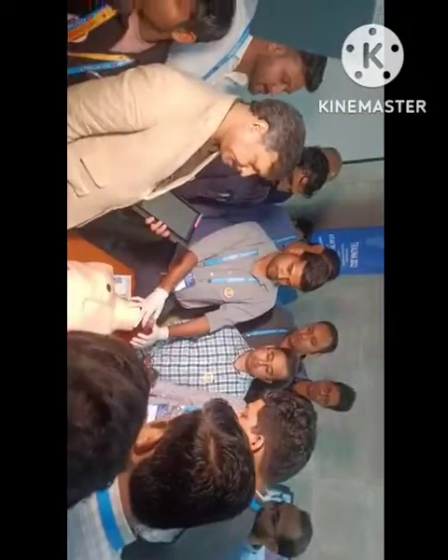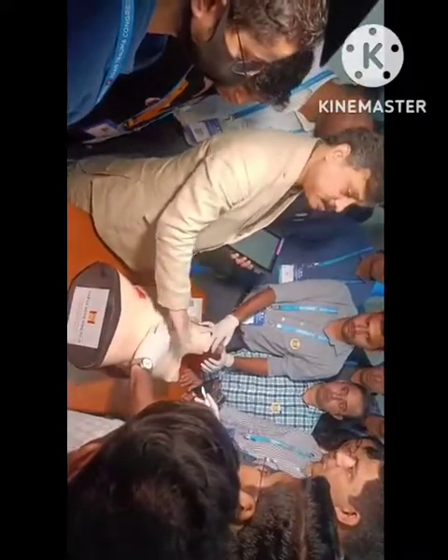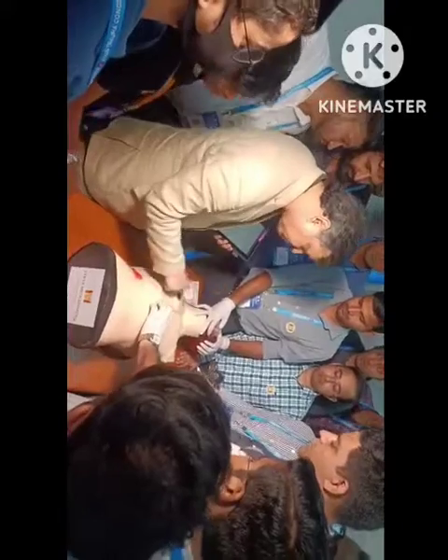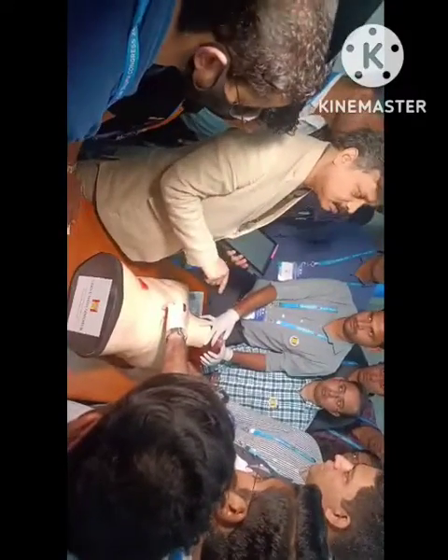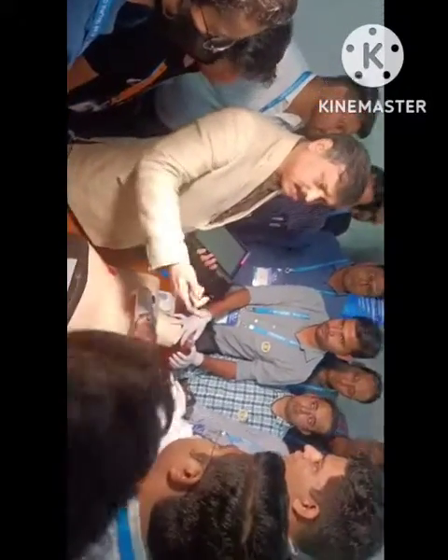I will start my incision from the mid-axillary line to the sternum, just left lateral to the sternum. I will differ from you. We will always start the incision from the right side, even for left anterolateral, so that if we need to convert to clamshell, we can. So the incision, even for left anterolateral, will start from the right side of the chest, the right nipple. This is an international recommendation.